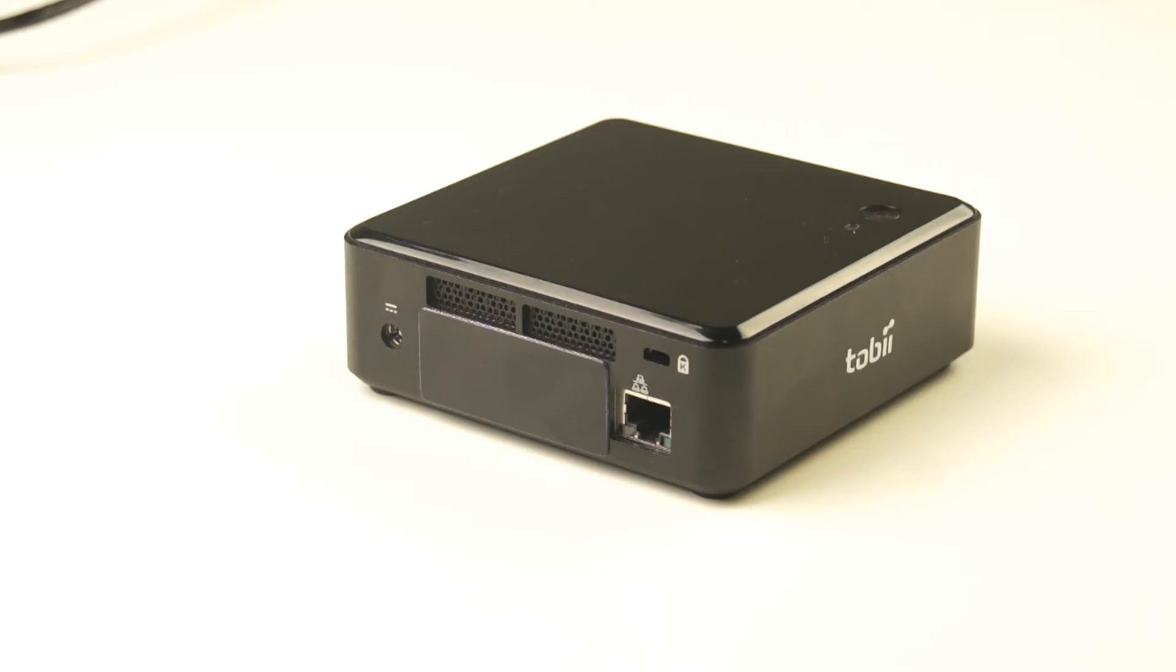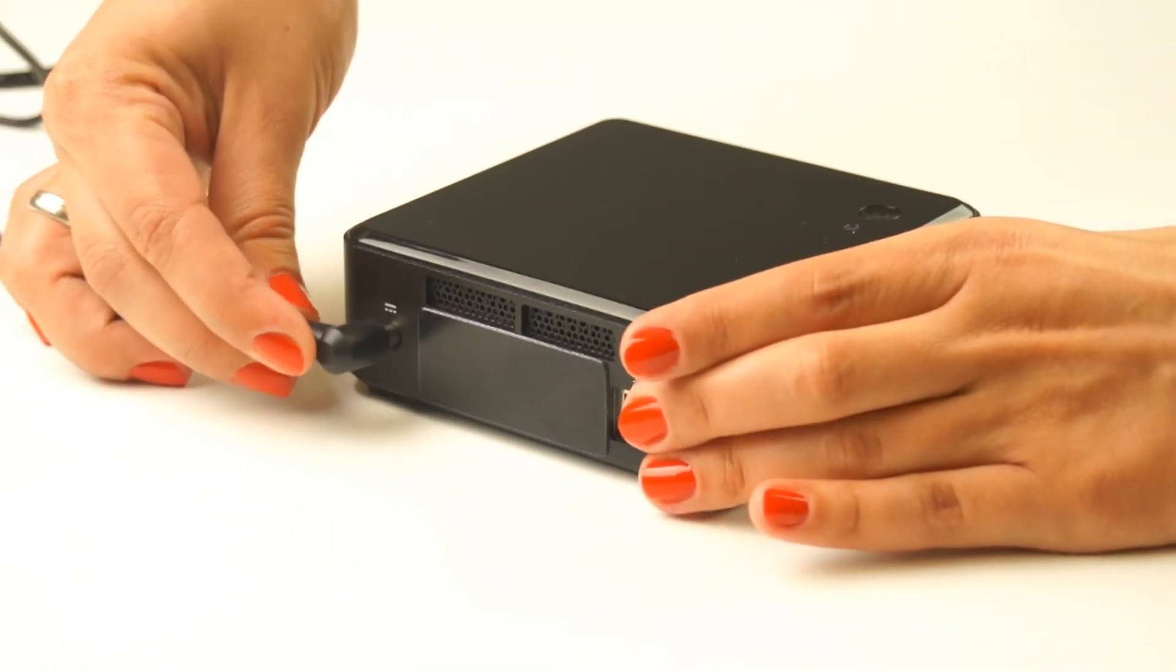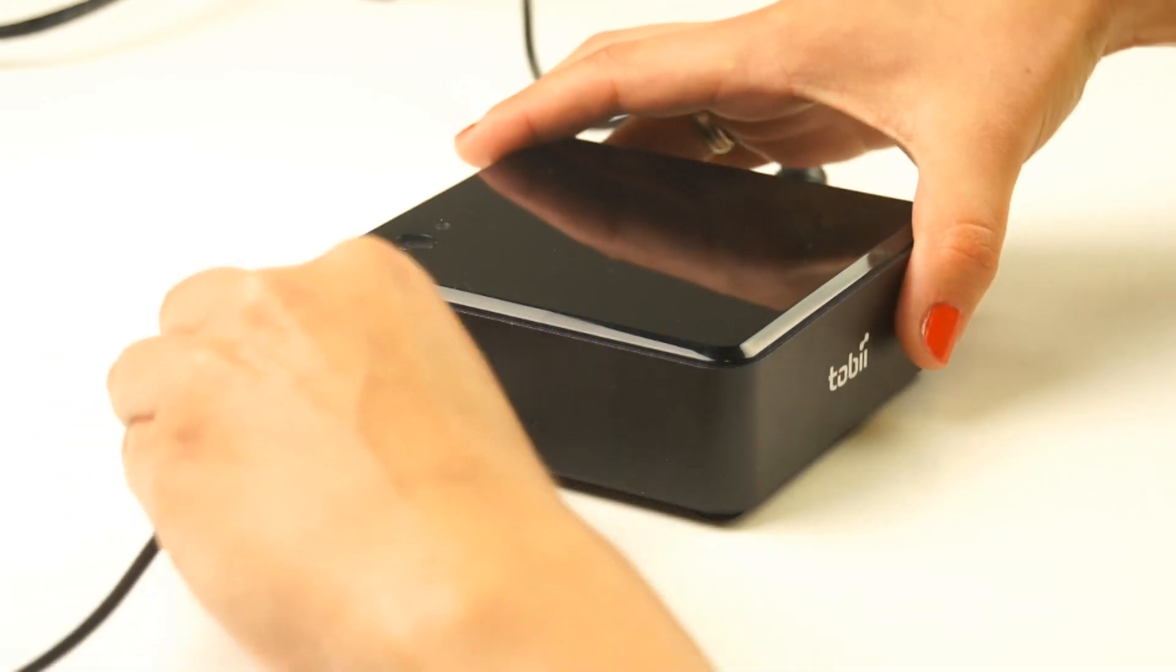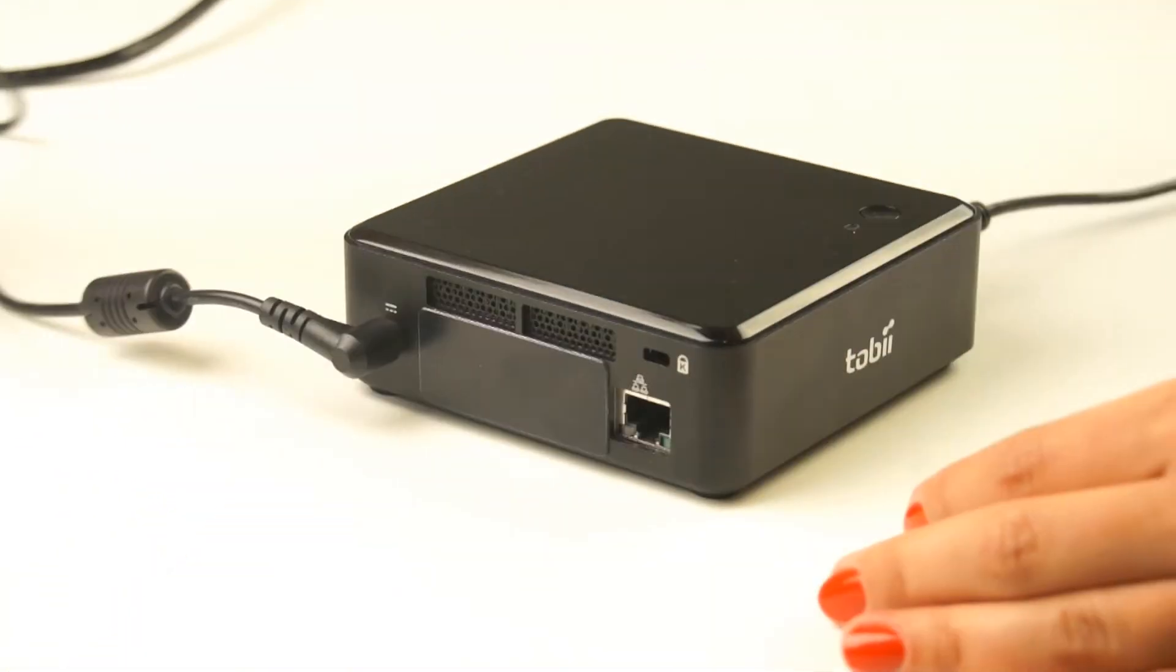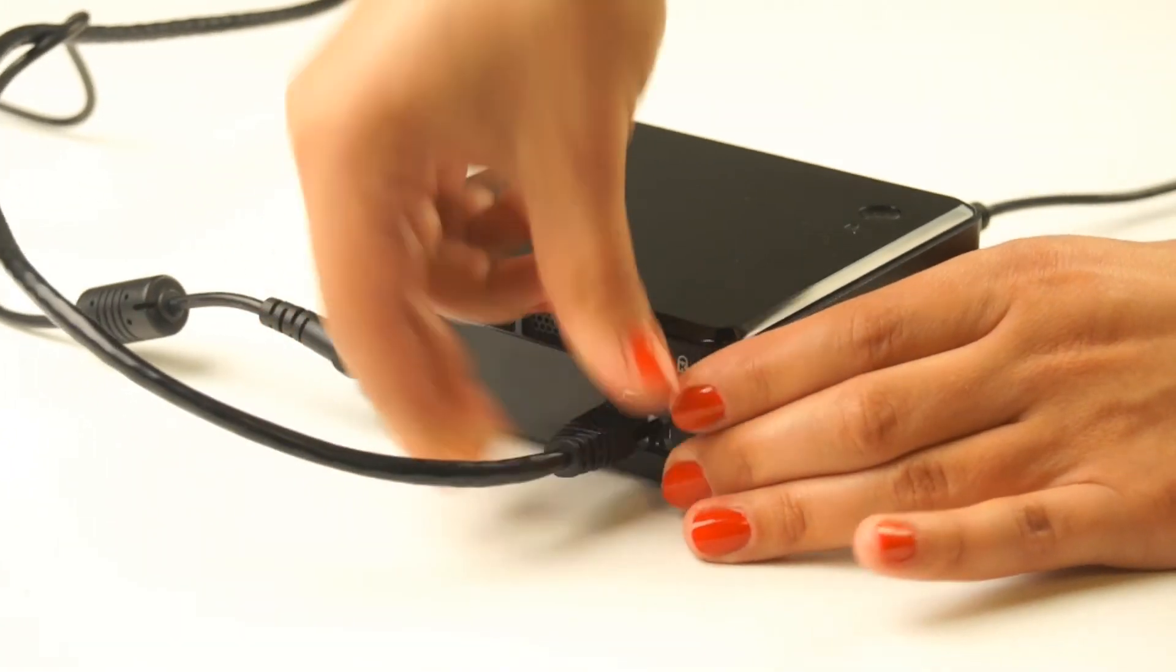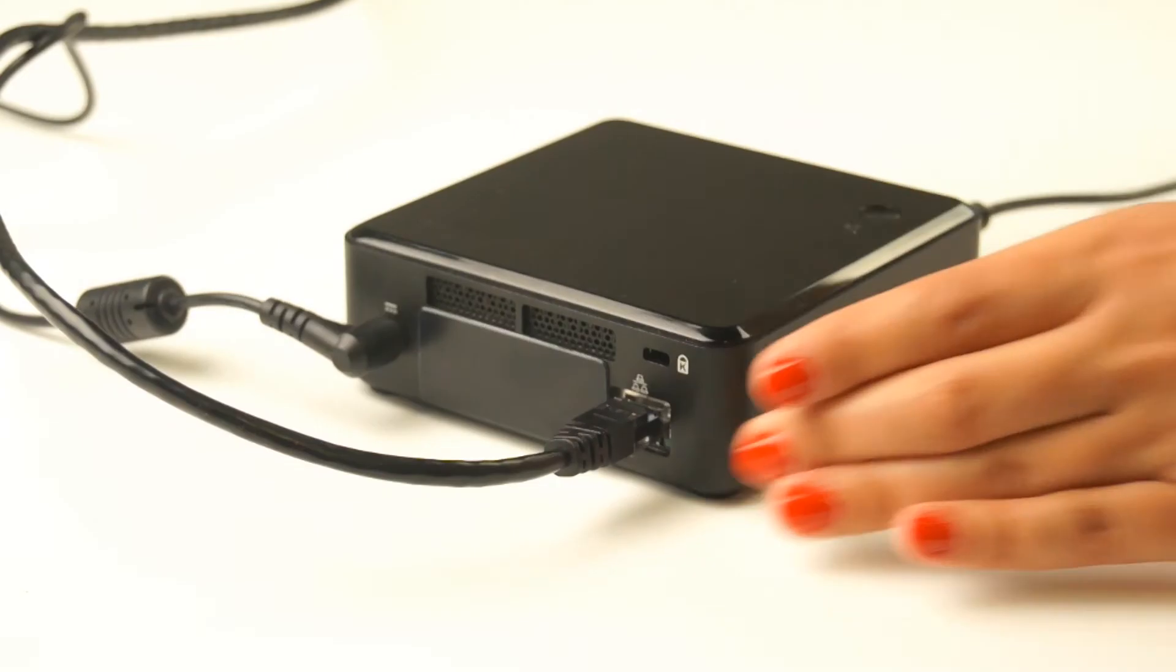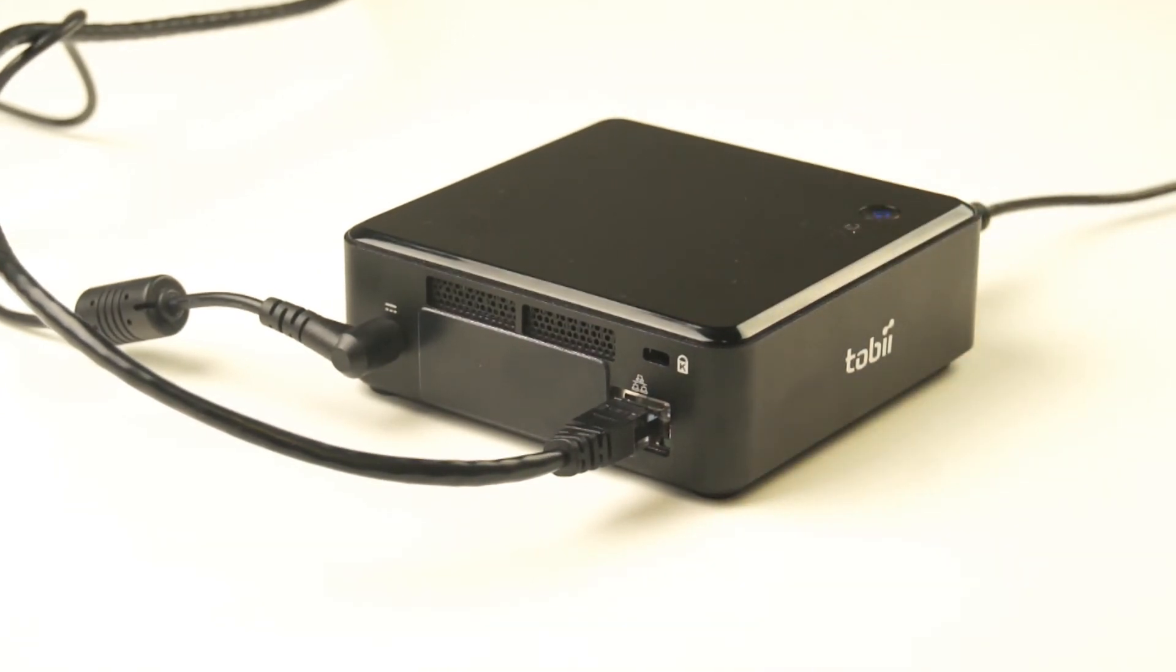If you have a Tobii X2 eye tracker with an external processing unit, start by connecting the power cable of the unit. Then connect the USB connector of the eye tracker to the processing unit and the Ethernet cable between the processing unit and the computer. Press the button on top of the unit to turn it on.